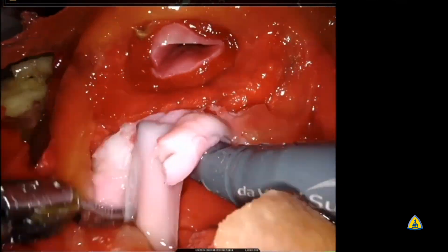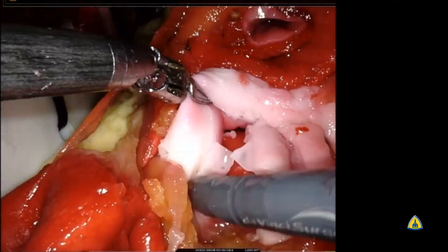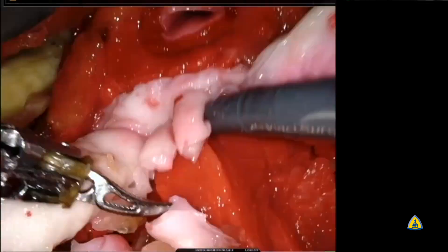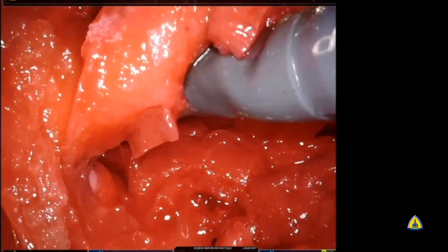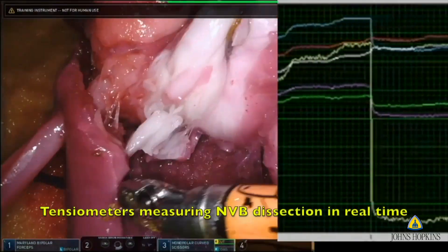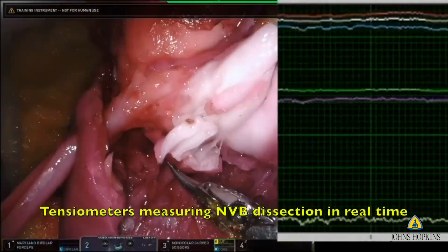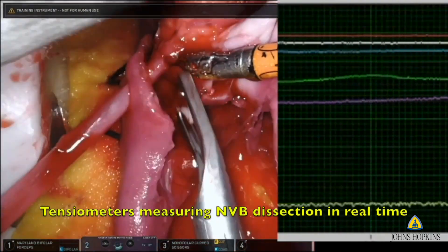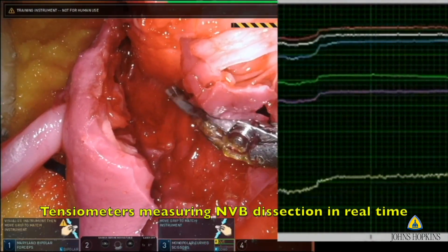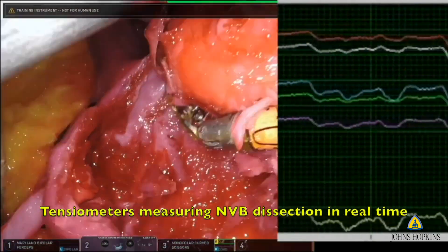The seminal vesicles are buried underneath the prostate, requiring retraction from the fourth arm. We're able to create soft fibro-fatty tissue as well as dense fat by altering the formula of the hydrogel. After the posterior dissection, the trainee moves to the pedicle, which is very evident with its pulsatile flow as soon as they cut through it, requiring clipping. The readings on the right are data collected in real time from the sensors in the neurovascular bundle.